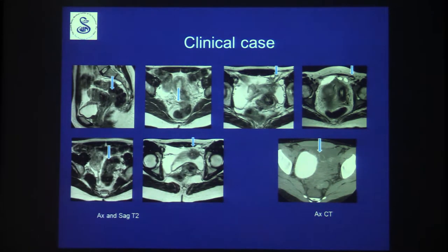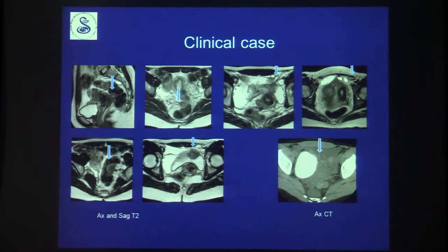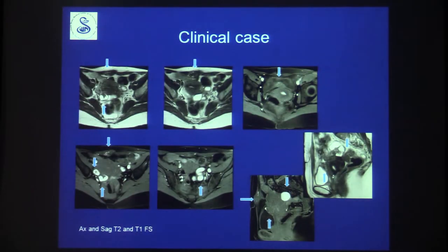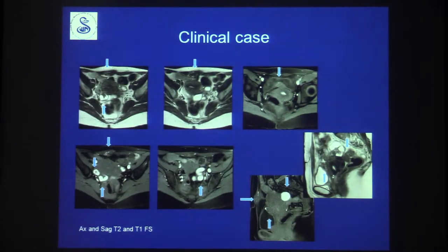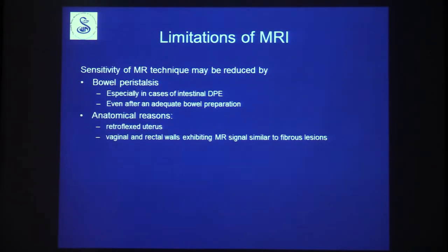These findings don't come in isolation — even if one lesion is found, look for others. One case demonstrates simultaneous bowel involvement, bladder involvement, sacro-uterine involvement, round ligament involvement, and abdominal wall involvement all in the same patient. Another case shows abdominal wall involvement after cesarean section with endometriosis extending to the uterus, bladder involvement, endometriomas, both fallopian tubes involved, and bowel involvement. Cases are usually complex and MRI maps them all preoperatively.